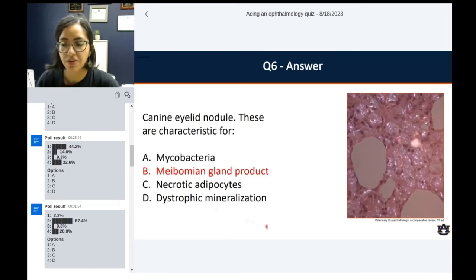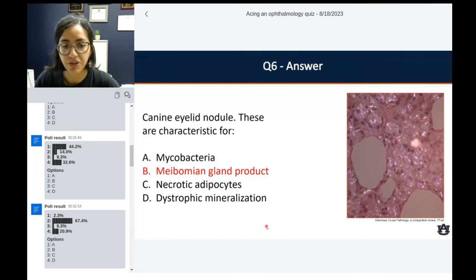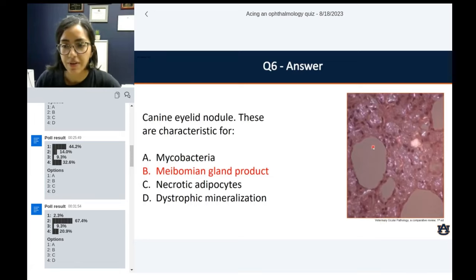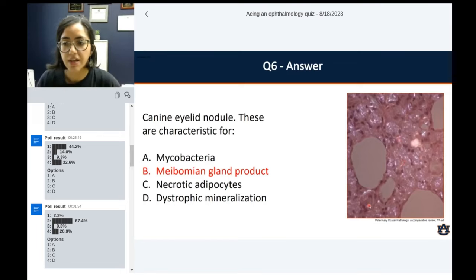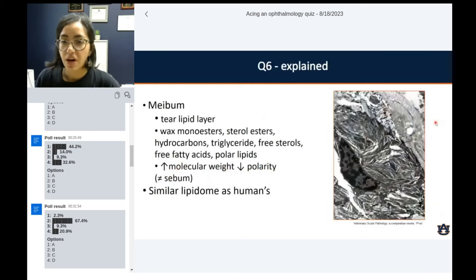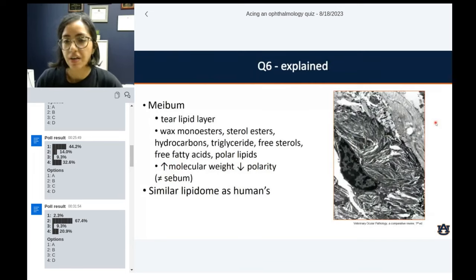The majority of you folks answered right — this is actually consistent with meibomian gland product. What we're seeing here is a higher magnification of this eyelid nodule under polarized light. These are probably free lipid that are ruptured and being encased by the granulomatous inflammation. All these guys are epithelioid macrophages; there are some multinucleated giant cells, and they're chock full of these needle-like, very delicate, birefringent crystals — characteristic of a byproduct of meibum.